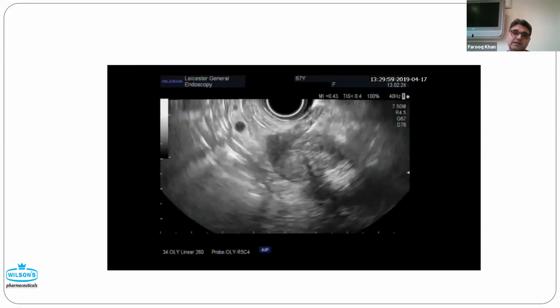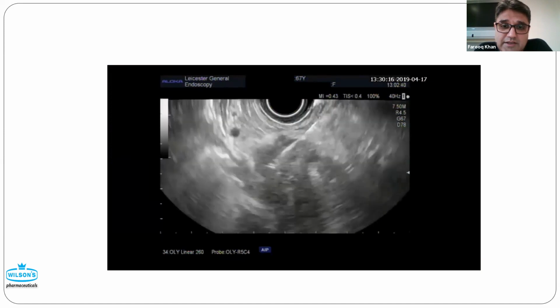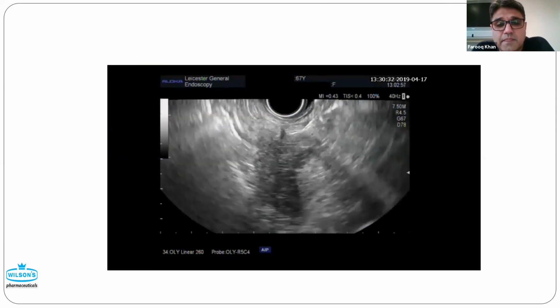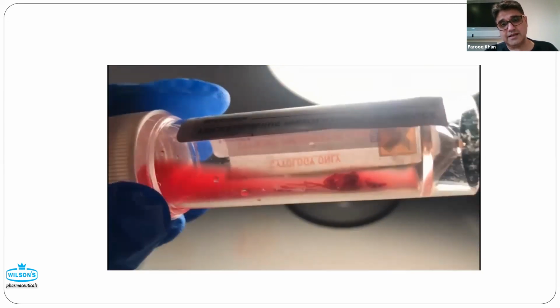You can see from starting point 1 to starting point end. Come back at the lesion, fanning technique, move your scope around. You can see the different parts of the lesion. Now you go back in and you take samples. I think I've also got, yeah, so that's the core, a beautiful one that we got, and that's how we collected it and sent it through.